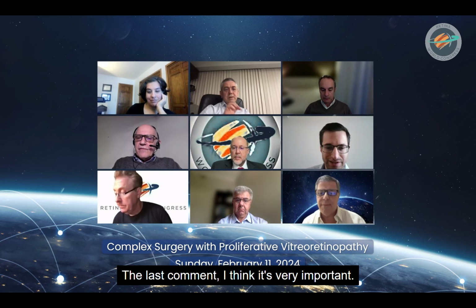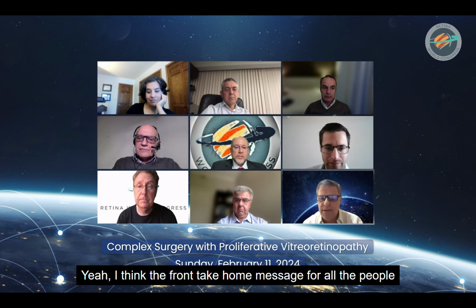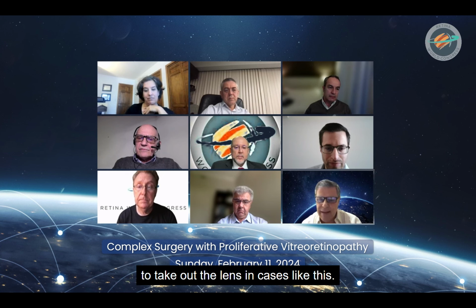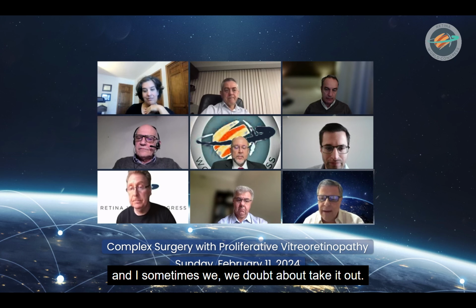The last comment. Yep. I think it's very important. Yeah, I think the take-home message for all the people who are watching us is to take out the lens in cases like this, because when we operate a pseudophakic eye, sometimes we doubt about taking it out.